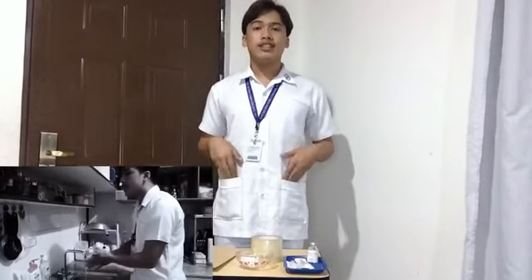So in preparing medication from the vials, first perform hand hygiene. This is to deter the spread of microorganisms and to prevent cross-contamination. Next is prepare the medication vials for drug withdrawal. Next is mix the solution if necessary by rotating vials between the palms of the hands, not by shaking, because if you shake the vials, it makes bubbles.